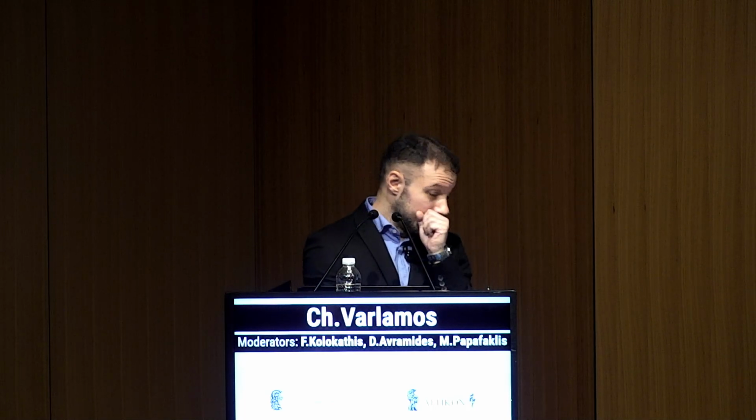Is it the lumen size? Is it the presence of dissection of the media that is anticipated, the non-recurrence? So imaging until now with DCB was marginally used. The same was with the physiology, unfortunately. And that is a crucial point to get information in what is optimal and when you can say, okay, I got imaging or I got physiology, that is enough predicting of a good result. I can avoid a two-stent.